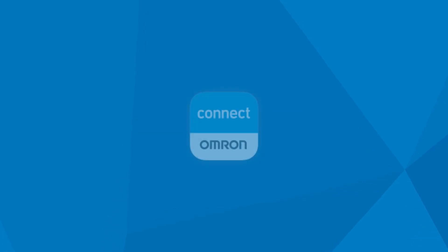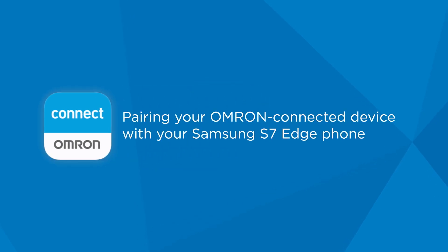To use the latest version of the Omron Connect app with your Samsung S7 Edge phone, here's a quick tutorial.